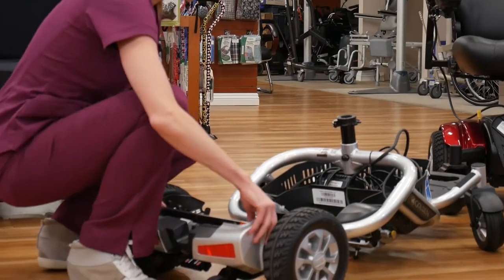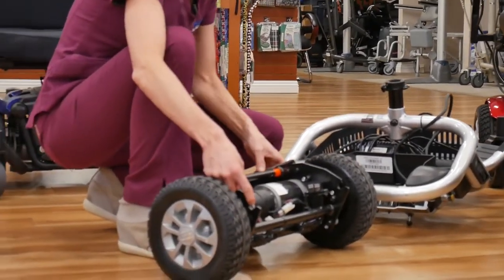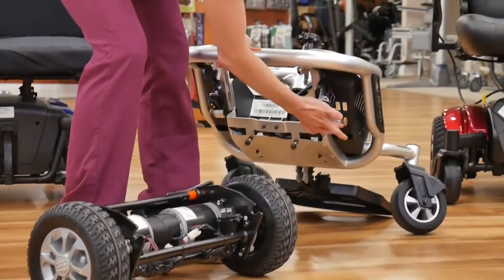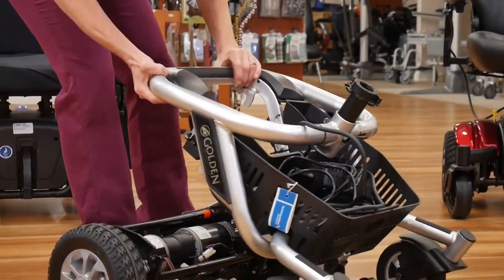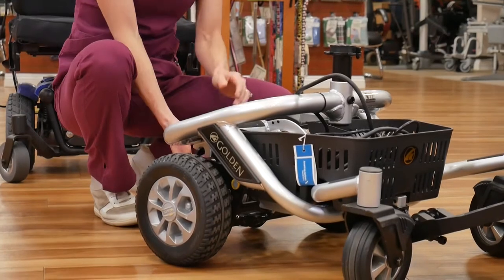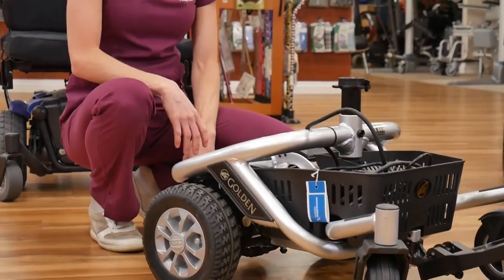When you align the frame with the motors, you want to find the little cutouts — the little saddles — and that's where the yellow piece slides in. Just line them up, and then that same lever you pulled before: pull and push down, and it locks in place.